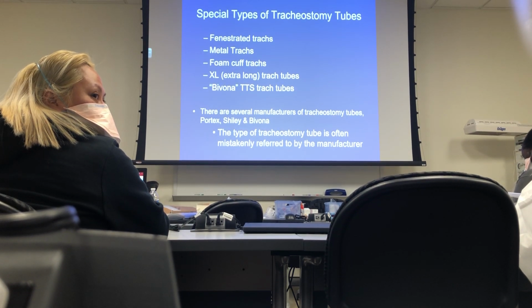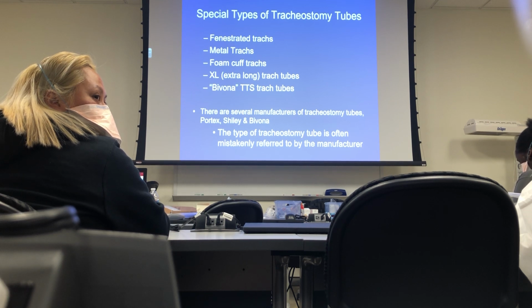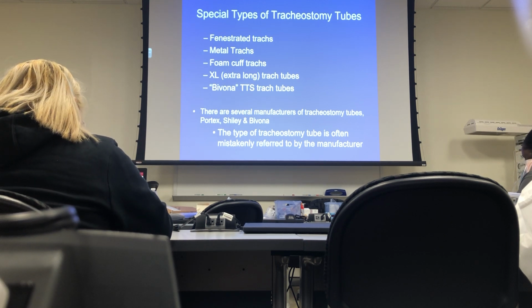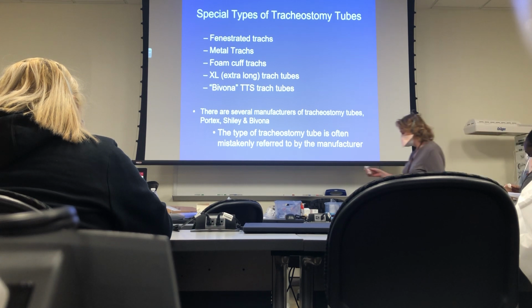Okay, let me see if this fits. There you go. No, that doesn't fit. Okay. All right, so here you go. Okay. Inner cannula. That has a hole. Okay. What's the purpose behind the fenestrated trachs?